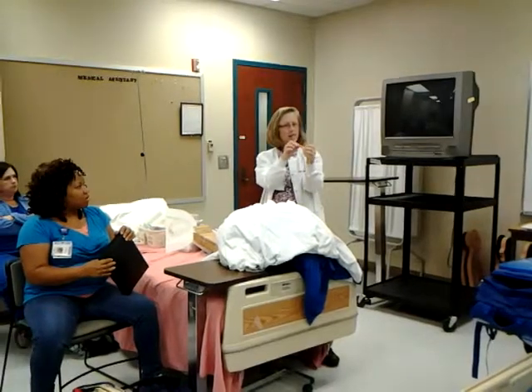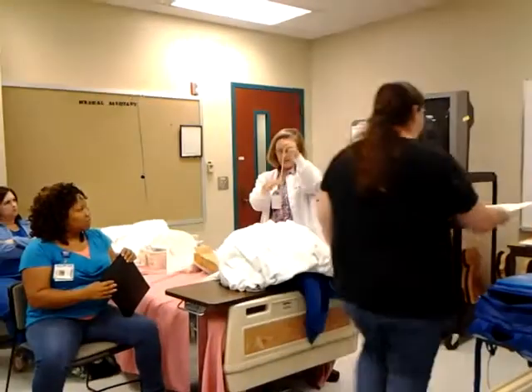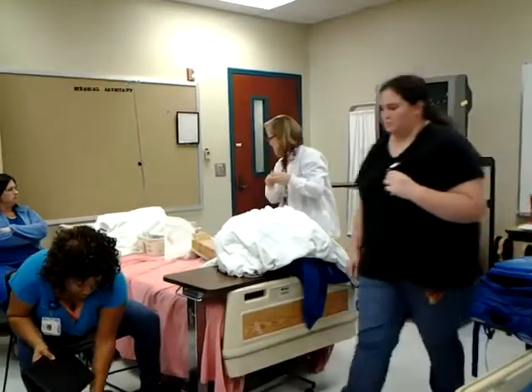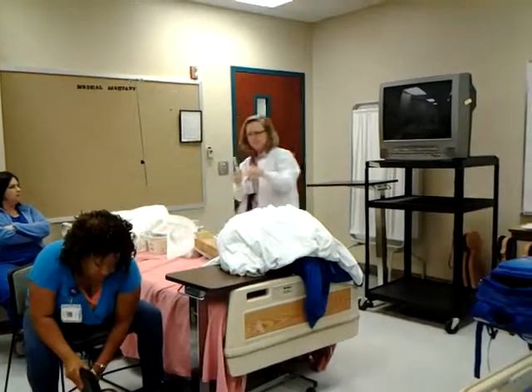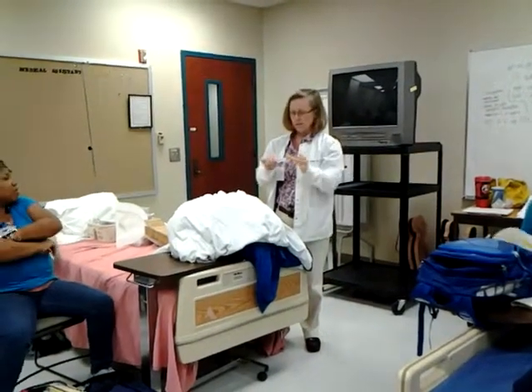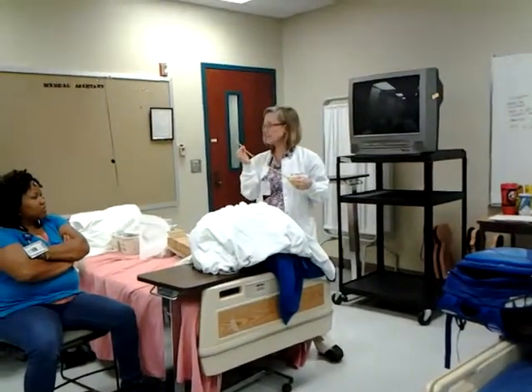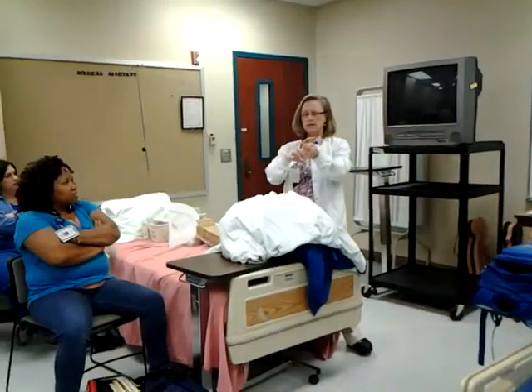The other lumen is for sterile water that will inflate a balloon. There's a balloon at the tip. It used to be that we tested the balloons before inserting them, but now they're pre-tested at the factory, and you are not supposed to test the balloon before putting it into the patient.